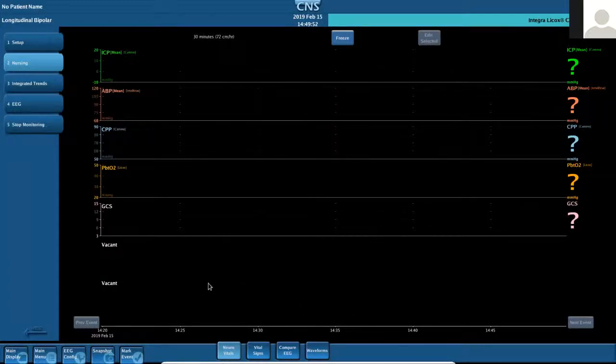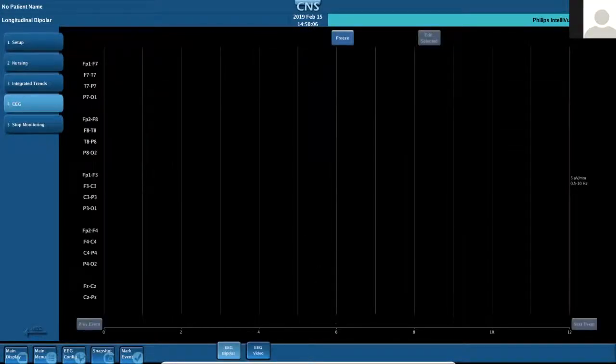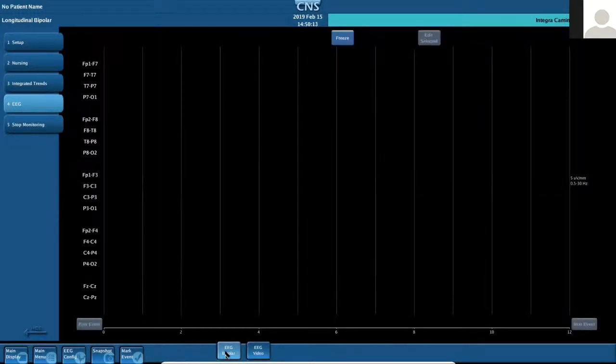Yeah, that's great. So just to remind everybody, the steps are there on the left. Remember, 1 and 5 we can't change, but you can create as many customized steps as you want. And then the displays are those little buttons down on the bottom that change as you move. Sometimes the terminology gets sticky, steps and displays. They're all just different ways of viewing different displays, but we call them different things on the side versus the bottom.